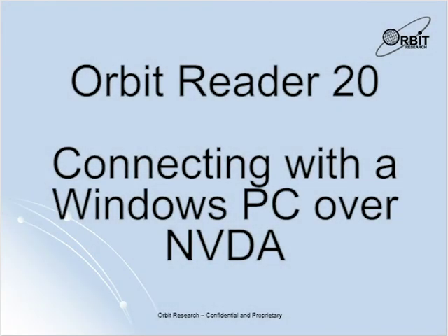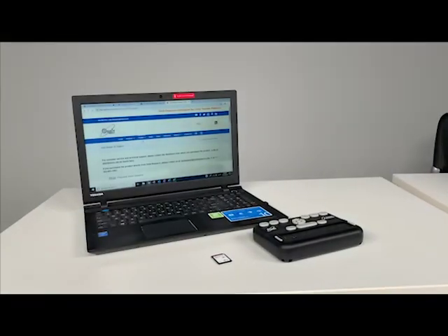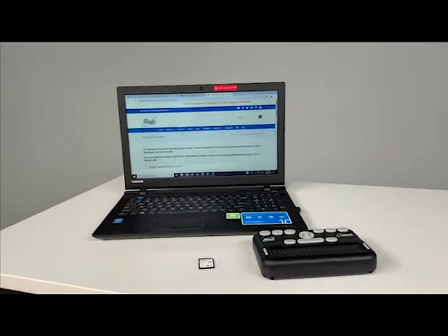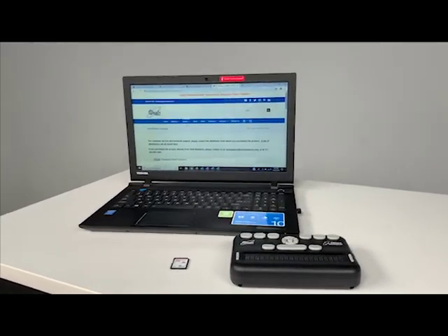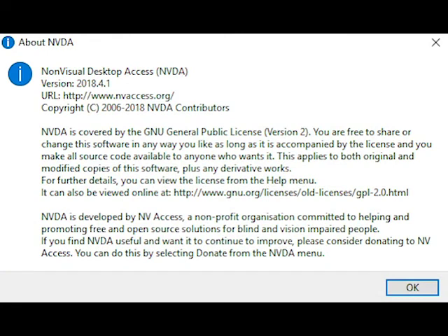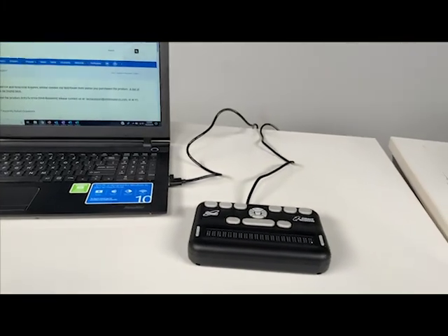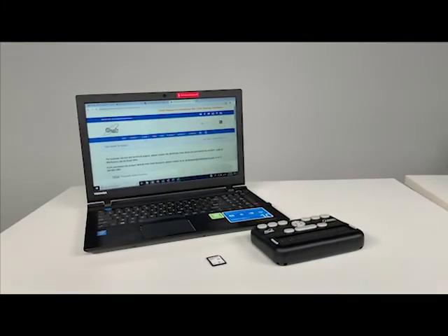Hello and welcome to the Orbit Reader 20 connecting with a Windows PC over NVDA video. Today I will be going over how to connect your Orbit Reader 20 device to a Windows PC with the NVDA screen reader. To begin, first ensure that your NVDA screen reader version is 2017 or newer. You can connect your Orbit Reader 20 to your PC by USB connection or by Bluetooth.